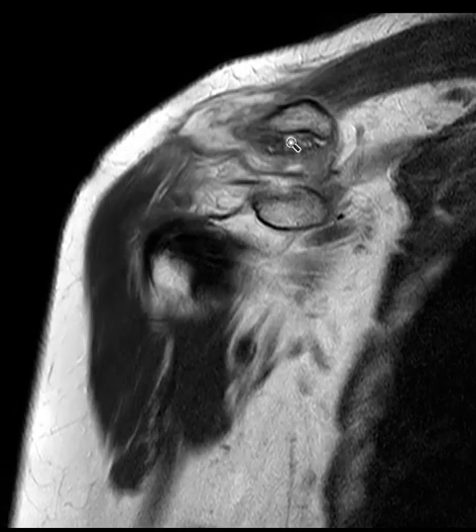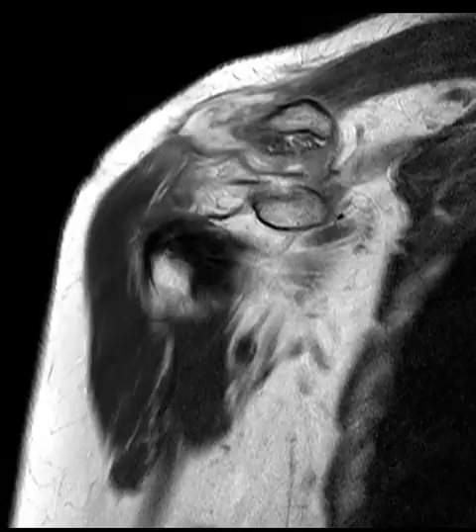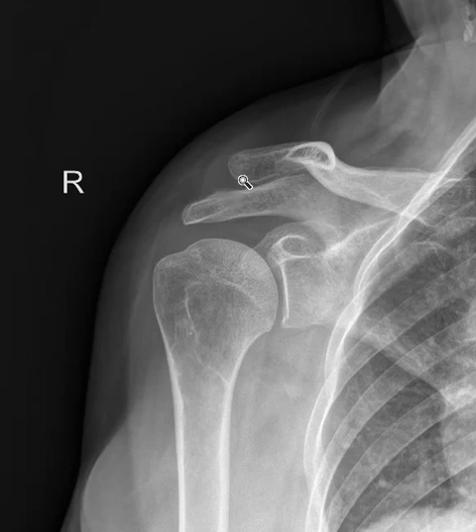In another view, we can see that ligament complex coming across horizontally — dark and well-defined — with a complete tear all the way across, ripped like paper through here, with widening between the bones. On X-ray, this is the coracoid process and the clavicle ending here; this distance is way too wide because the clavicle has drifted superiorly. This is the AC joint — the clavicle should be lower and close to the acromion process, but it is widened and elevated.